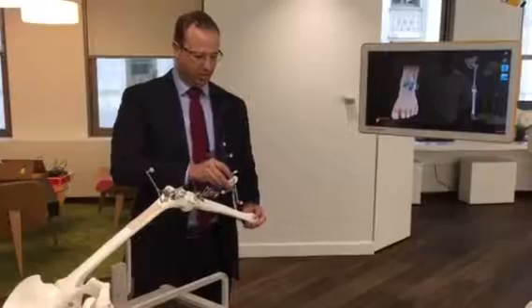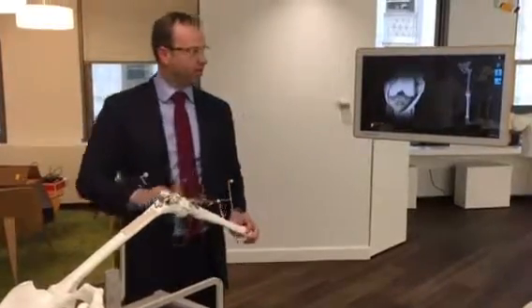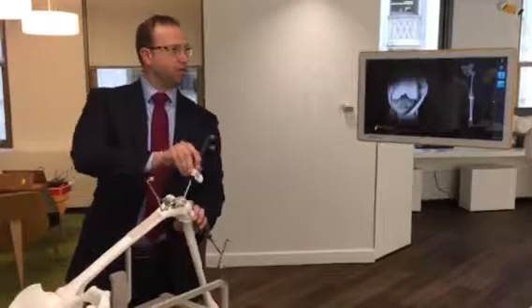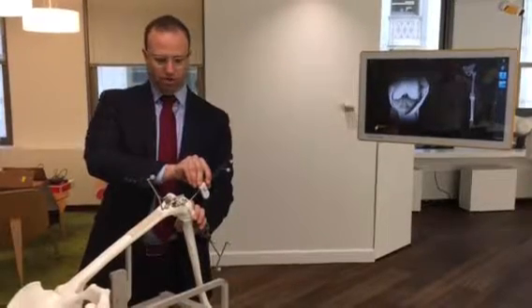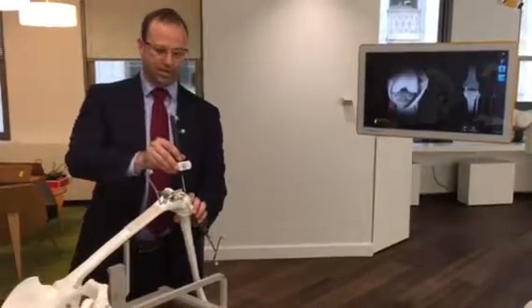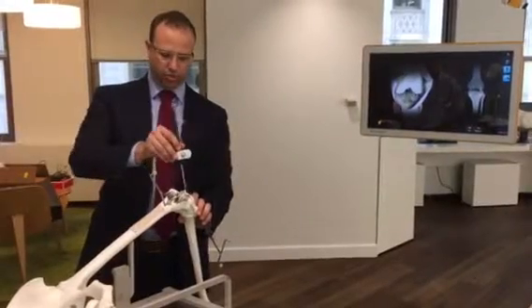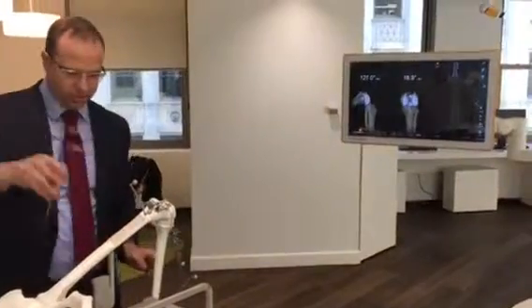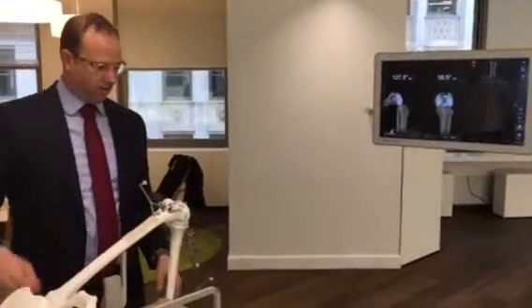Ankle point, if I put them in reverse, the software would take it and flip around for me. Entry point into the tibia, rotation straight over. A single point on the tibial plateau to reduce the registration. And you're going to kind of want to pick the point in which you put a stylus later on, right?